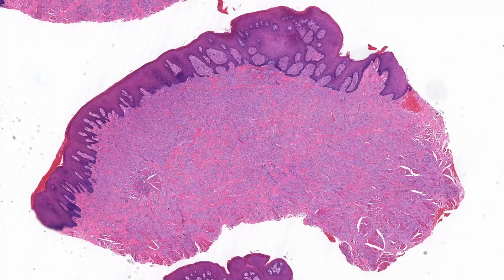Case number 1 is a lesion on the oral mucosa of a 52-year-old male. To start things off, I want to talk briefly about how to approach unknowns cases and describe what you see on a slide. If your program is anything like mine, you'll be doing this a lot as first years, and I recommend coming up with a systematic approach. It's a good way to organize and communicate your thoughts, and you'll be less likely to miss something important.